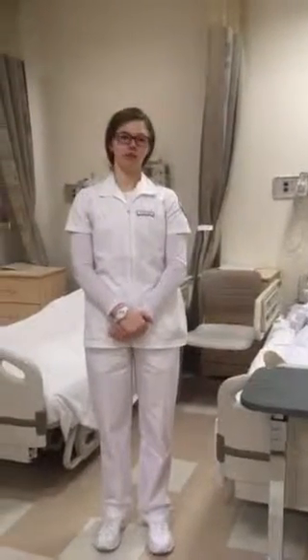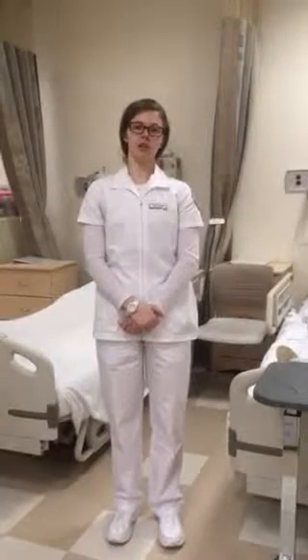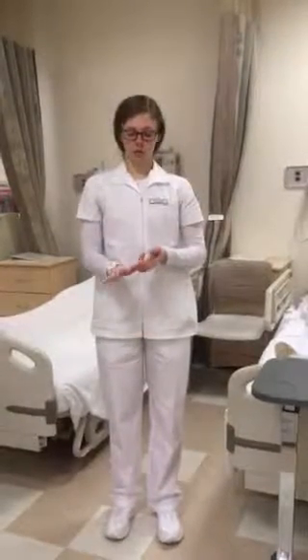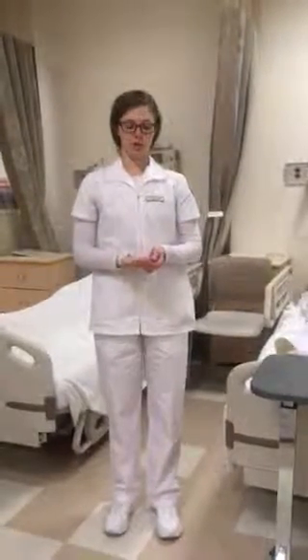Today we're going to be going over transferring a patient from the bed to the wheelchair. So to begin, we're going to recite our 7 steps. Number 1 would be to check the physician's order. Number 2 would be to wash your hands. Number 3 would be to organize your equipment.